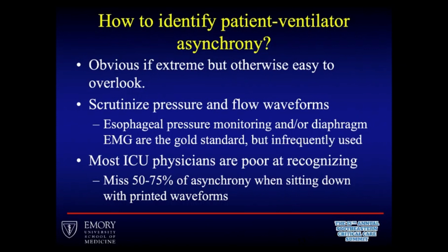While I appreciate the earlier talks and think that using more data is generally better, the truth of the matter is we don't always have esophageal balloons, and we probably rarely have them. Those and diaphragmatic EMG are the gold standard for determining whether patients are having certain types of dissynchrony, but they're infrequently used.